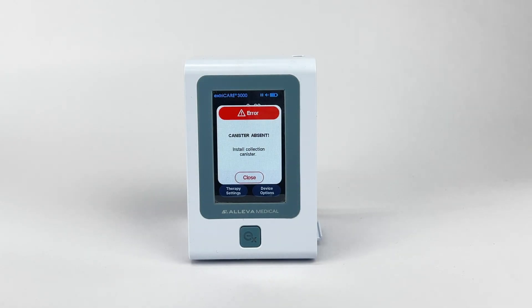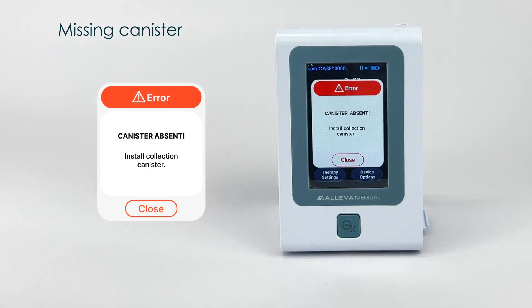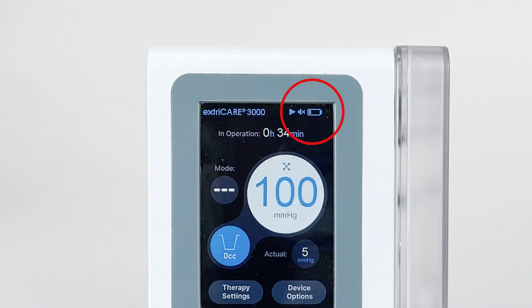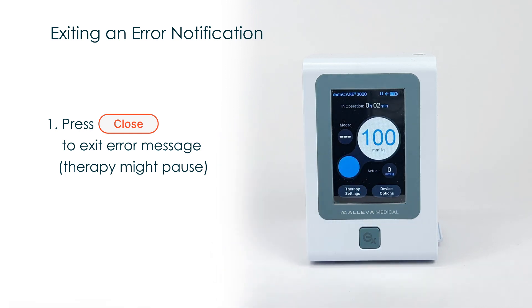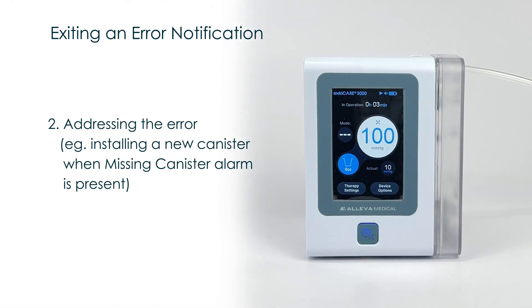Error Notifications. The ExtraCare 3000 provides audible and visual notifications when an error occurs. On the touch screen, an error message will appear along with how to address the error. When an error is occurring, the EX button will flash red followed by beep sounds. Some common situations that will cause an alarm include: the device is tilted, a canister is missing, the canister is full, low battery, or when a leakage is found in the system. Exiting the alarm can be done by pressing the oval red-bordered close button. In some instances, the therapy might be paused and immediate actions are needed to fix the issue.